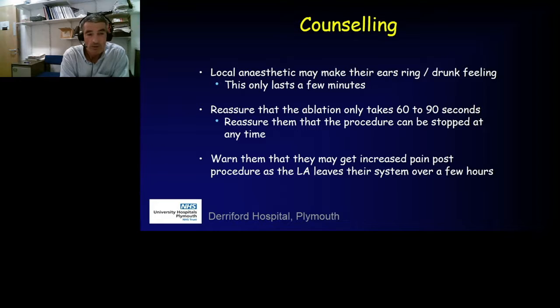And also reassuring the patients that the cautery takes 60 to 90 seconds, so it's short-lived, so even if they are slightly uncomfortable, it is very time-limited, which they find reassuring. And also letting them know that it can be stopped at any time should they ask. Not that we've actually had to do that to this date, but I think it's important that they know they can.